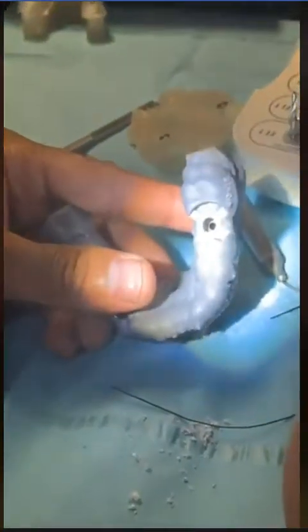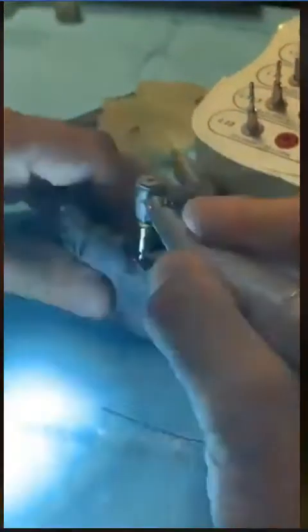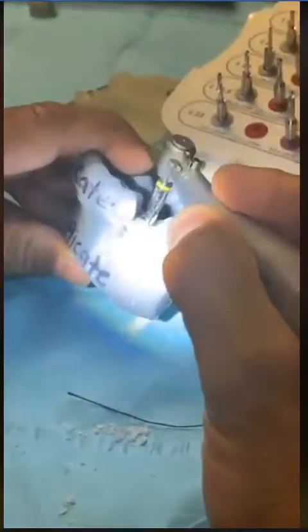Okay, look at your osteotomy. It's perfect, in the right spot, exactly where you want it to be. Okay. Next burr, I'm actually going to skip one burr over here. I'm going to go into the last burr before the implant goes in. Okay, now let's try this out. I'm probably going to be able to engage it anyway.